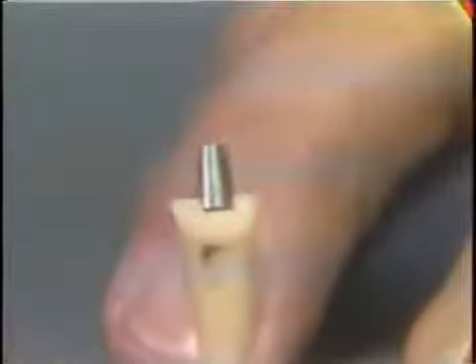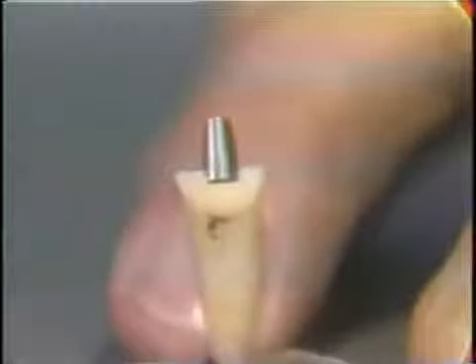see how the flats on the post slip down into the slot on the top of the preparation, and you'll recognize now that this is the prefabricated shape to the core. It's not been finished or shaped to match the preparation. It will be too wide across the incisal in its present form, and of course in shaping the labial and lingual surfaces you develop the same shape which you've seen in the earlier preparations. The finished core post is then cemented in position and an impression taken, and the usual procedure followed for the construction of a veneer crown.